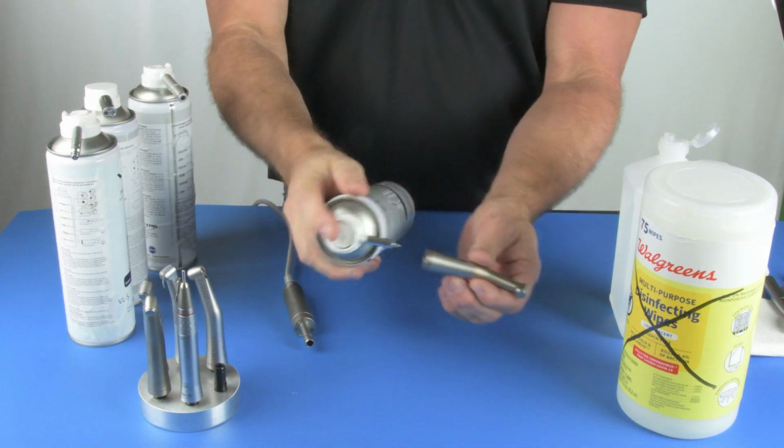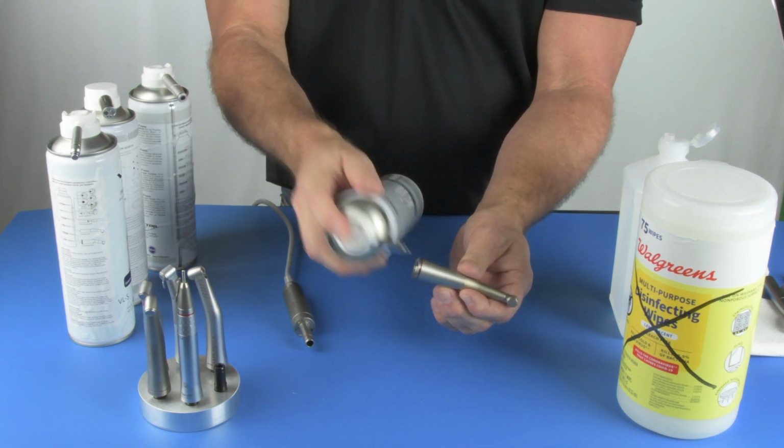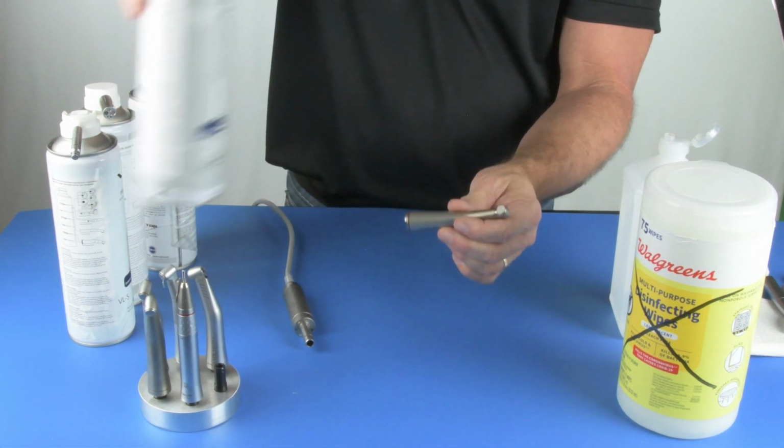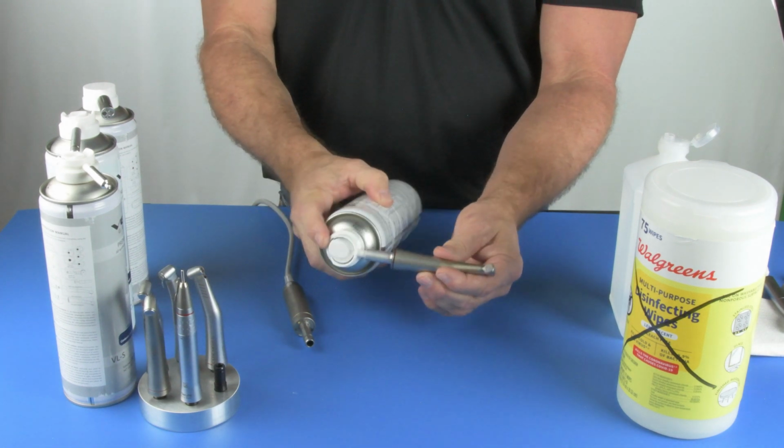So many times I see people using small nozzles like this to try and lubricate the handpiece. It does absolutely nothing. You might as well not even lubricate the handpiece. So it's very, very important to use the correct E-type adapter.